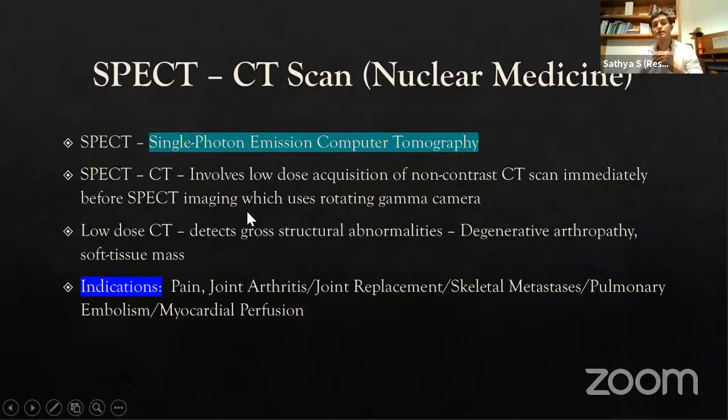With respect to SPECT, SPECT is nothing but single photon emission computed tomography. It's a recent advancement as well. Previously, positron emission tomography, or PET scans, were used. Compared to those, SPECT CT scans and the nuclear medicine uses for these are really good.